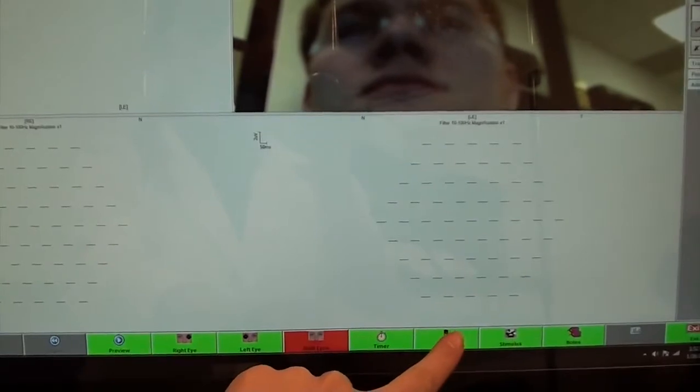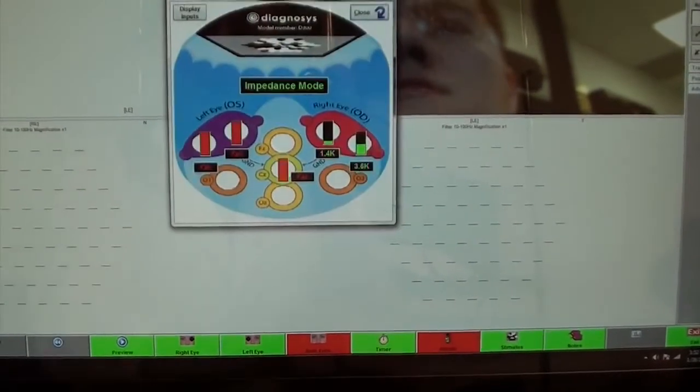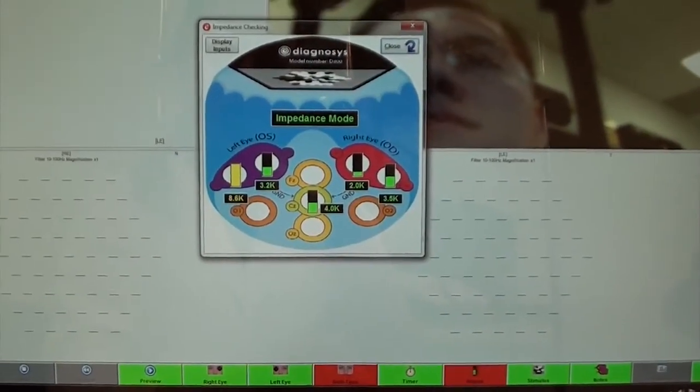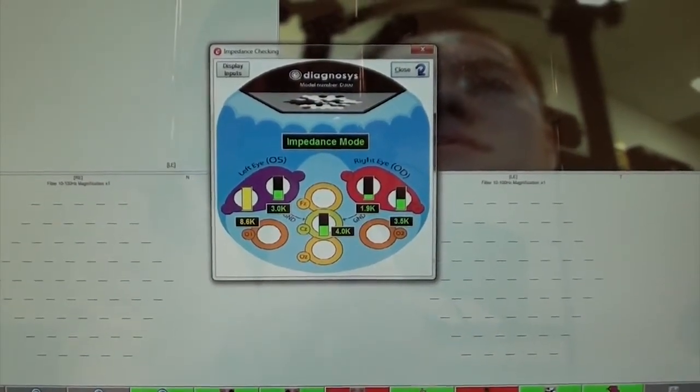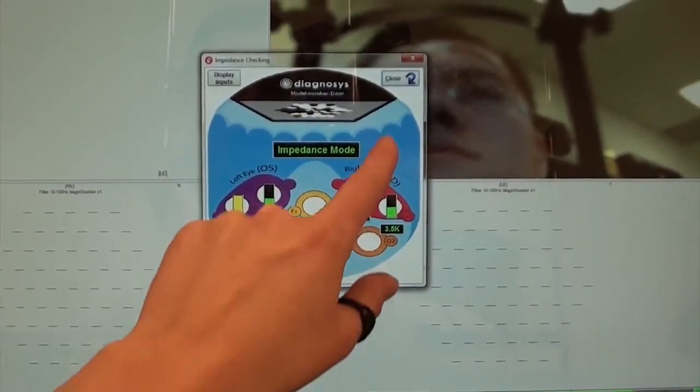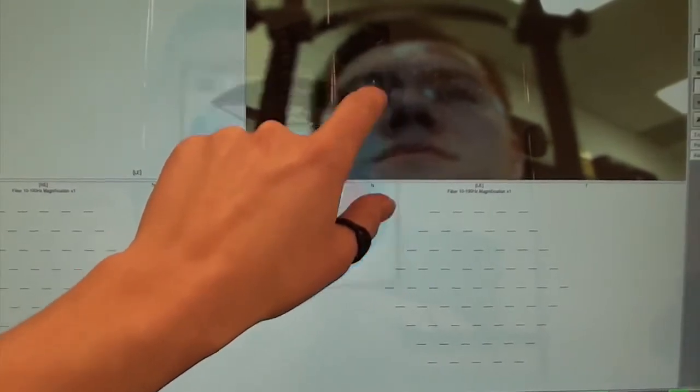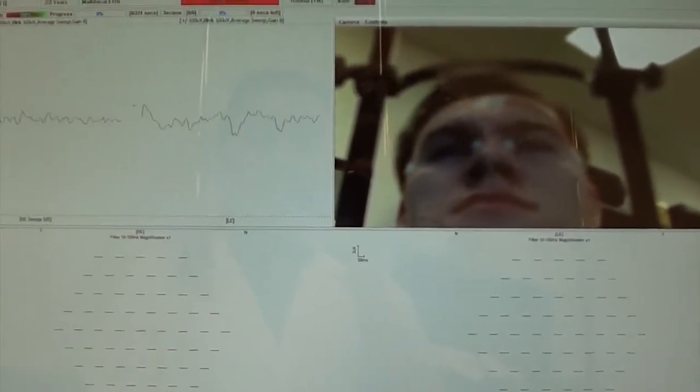Next, we check our impedance. If everything is below 10, we can close the window and preview the signal.